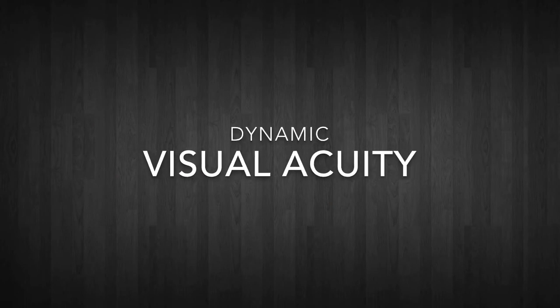Now the athletes will be doing a dynamic part of this test where they will be moving their head to an audible sound and reading the lines at the same time.